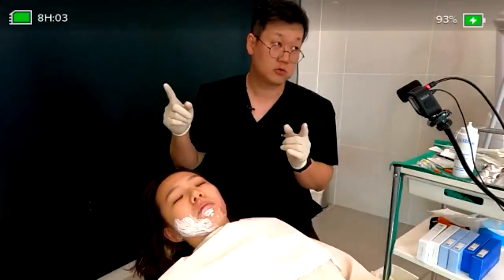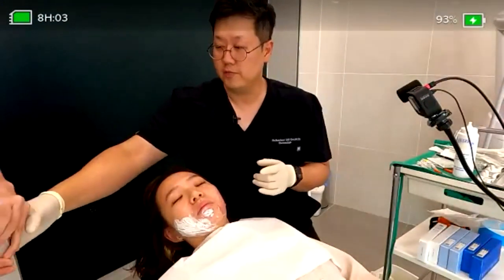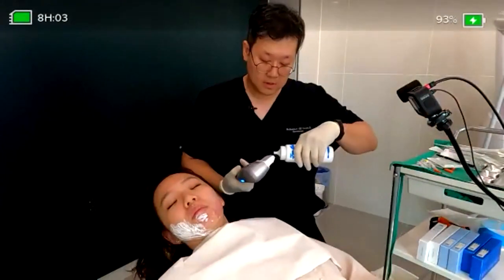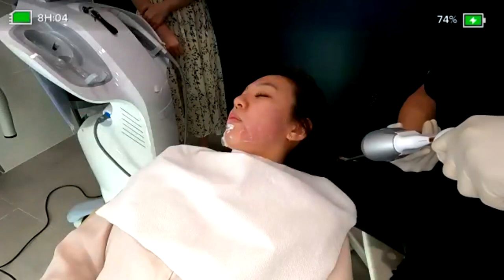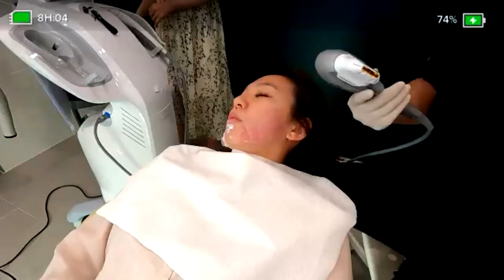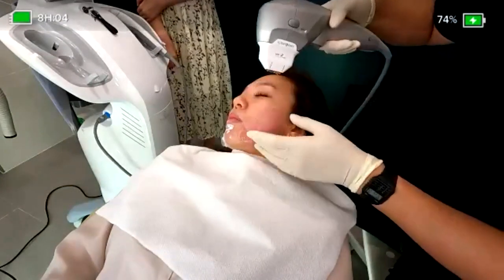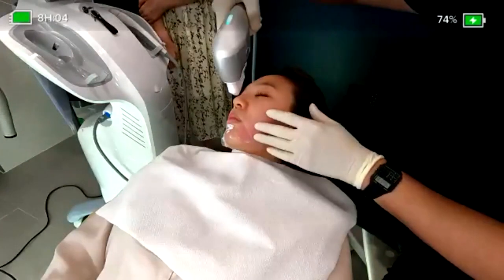And we will move on to the second layer using the NF2. It's a 2 mm depth, so we will go for that. This one is the same. This one is making the same lines, but usually the tip size and the tip shape are more sharper. So if you are using it on very small areas, it is usually quite useful.